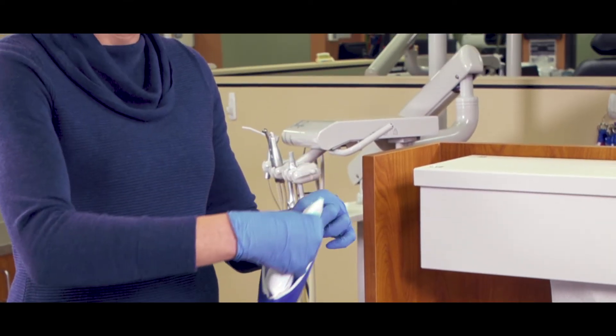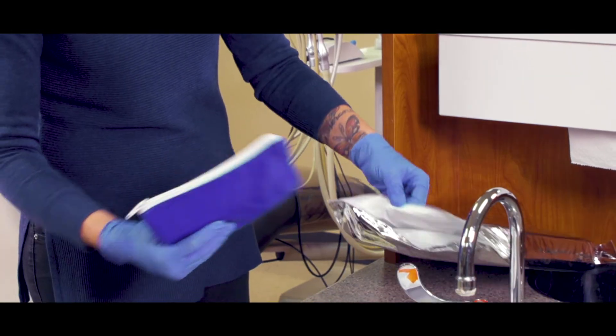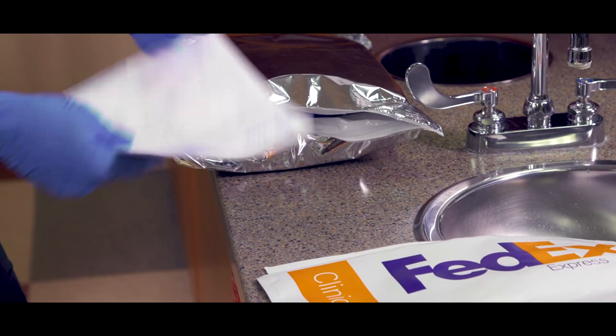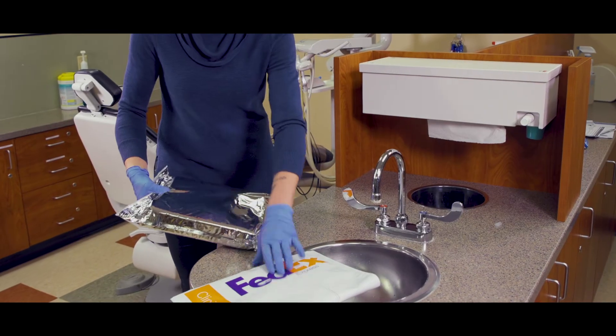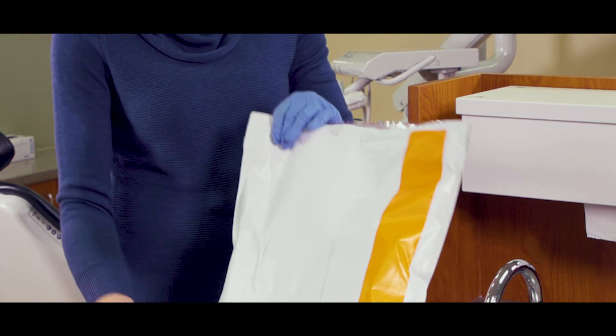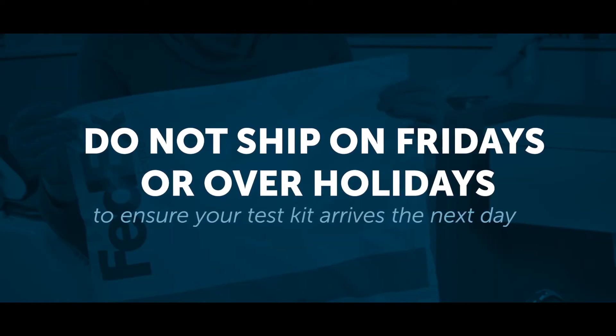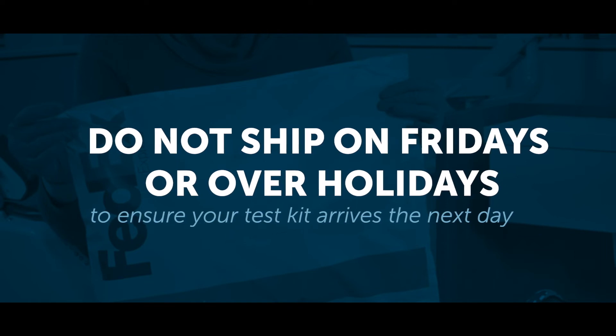Now that your ice pack is completely frozen, pack your vials inside the blue pouch, put the pouch inside the insulated mailer with the test submission form, and insert the silver mailer into the FedEx clinical pack. Call FedEx and schedule your pickup for the same day. Do not ship on Fridays or over holidays to make sure that your kit arrives the next day.